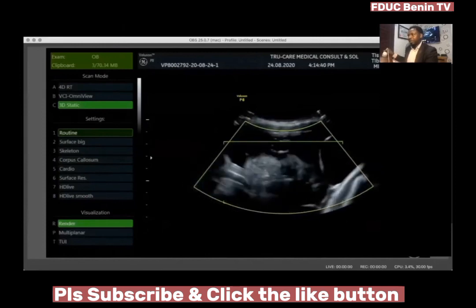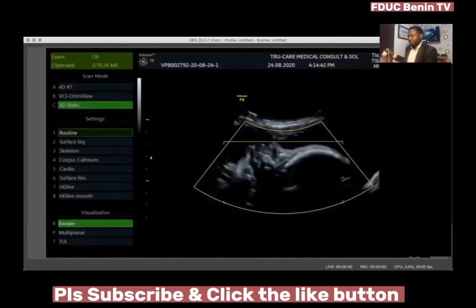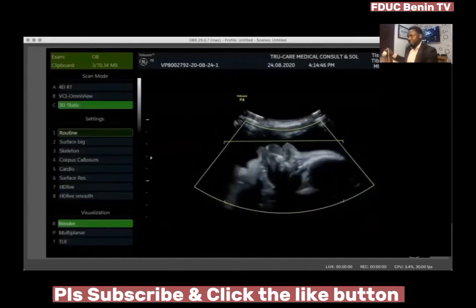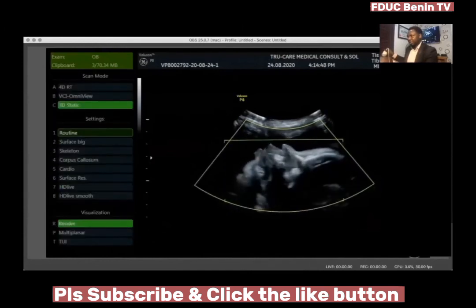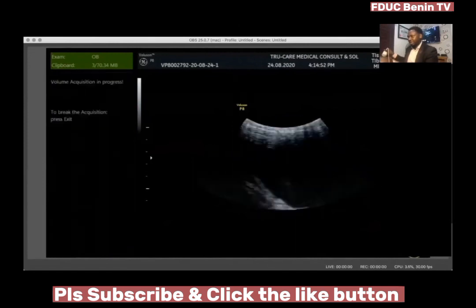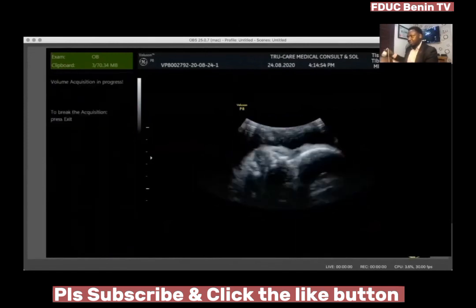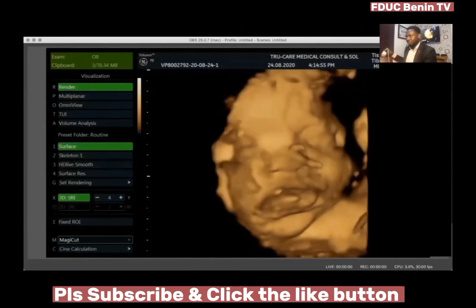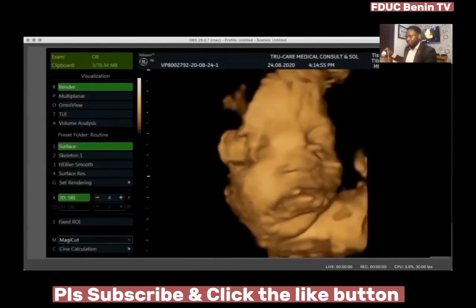So the main thing now for the image acquisition, just summarizing, is that you get a good plane like this, optimize the image, then you obtain, sorry, I'm a little too close because advanced pregnancy, multiple gestation, we don't have too much liquor, and I'm able to work with the image. For now, I would want to show us something.